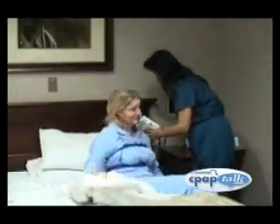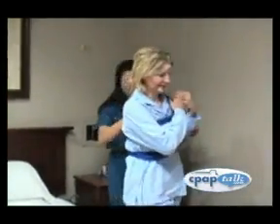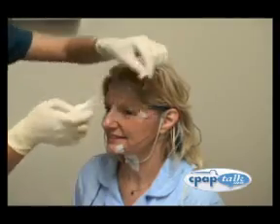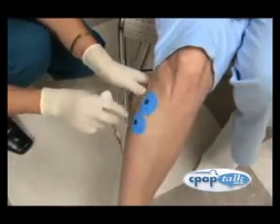When morning comes, your technician will wake you and remove all probes. The data is gathered and will be organized and scored before being reviewed by a physician specializing in sleep medicine. Your sleep study is the result, a detailed record of your body's sleep, along with any diagnosis and treatment recommendations.